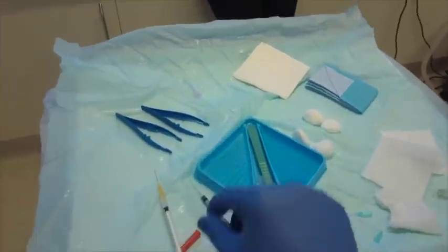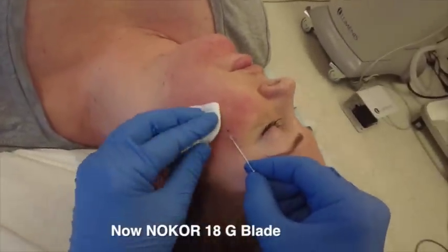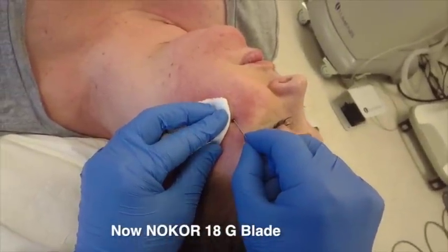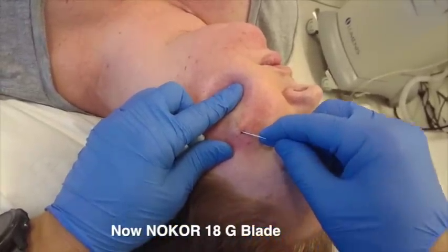The angle of attack is the same regardless of bending 23s and 21s. I'm now using what's known as a no-core needle. A no-core needle is used for hair transplantation. It contains a blade and I use this to break down fibrotic scars.